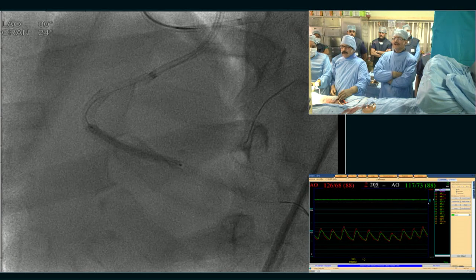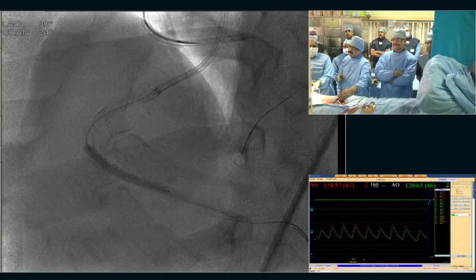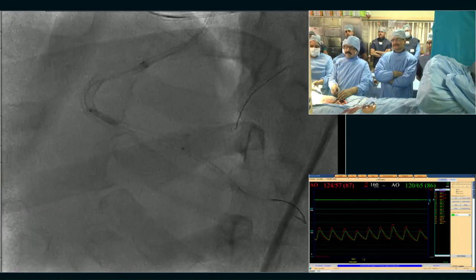Alexander, yes. Please, could you ask them? I think you are absolutely right. There is some staining on the PLV. Yes, the PLV is closed in the ISR, but it is retrogradely filling from the left system. So whether we should open it antegrade with a Crusade is another step. We will discuss that.